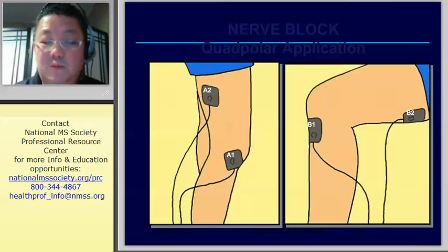Clinical indications, that's pretty much any time you want to reduce acute pain or any time you want to use a means of stretching, a means of decreasing muscle spasm or reducing spasticity. Very nice tool. If you haven't used it, I would encourage you to try that out.